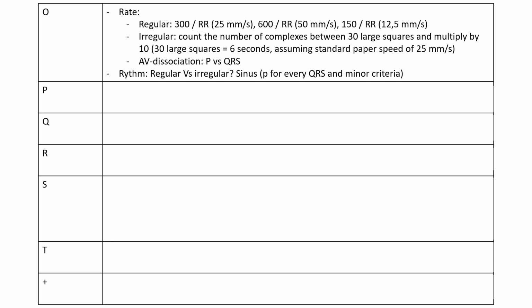But if it's irregular, then it's random, and it's almost pathognomonic for atrial fibrillation. When it's random, there's no pattern. That's where you take a piece of paper and make 2 markers. You mark the QRSs, and you see if they repeat or if they're just random all the way through. That's one of the main ways to diagnose atrial fibrillation, right? And then you see if there's sinus rhythm, right? There's a bigger definition than this, but the short definition is a P wave in front of every QRS complex, usually measured in lead 2.